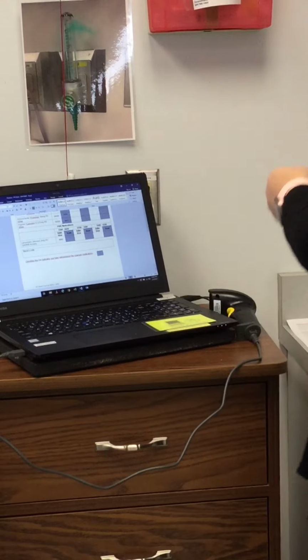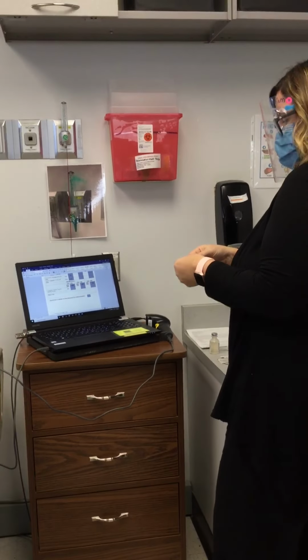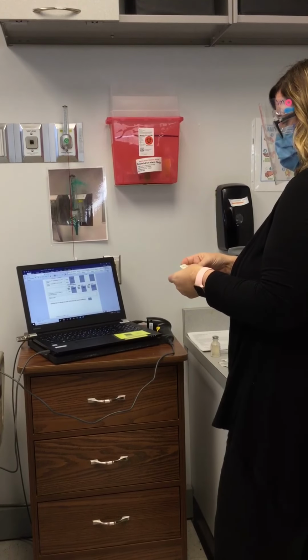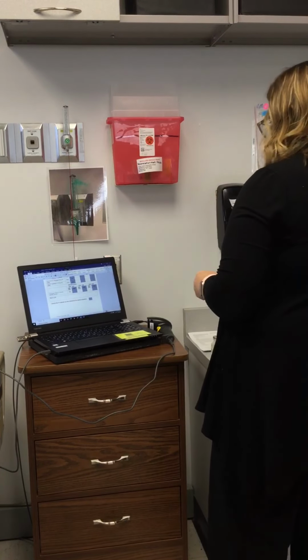So normally in real life, if you have a medication that doesn't scan, you should let the pharmacy know, because it's not good to do any overrides on meds. For purposes of time for this comp, we won't make you do that. We'll help you through it. But just so you know, it's not a good practice to get into not scanning your meds. These meds in this lab are very well loved and well used, so that's probably why it's not scanning.